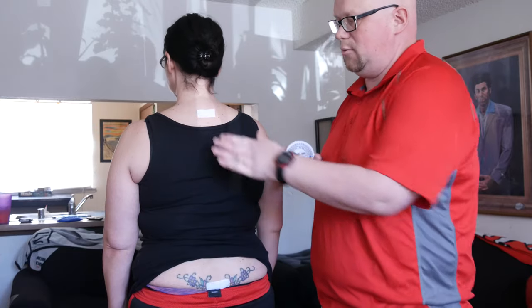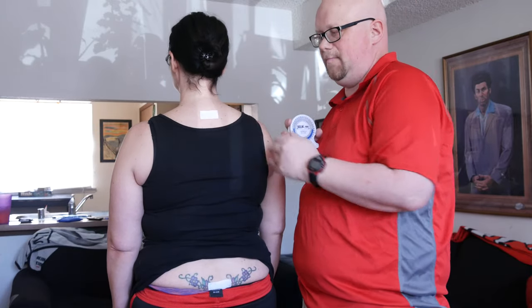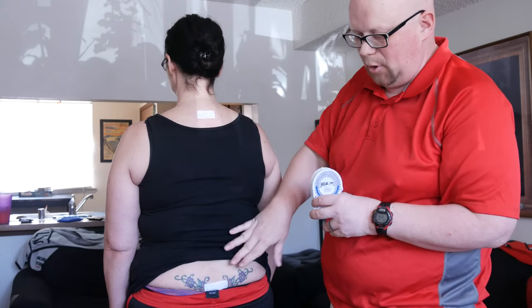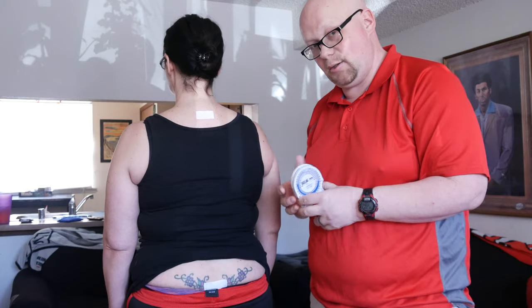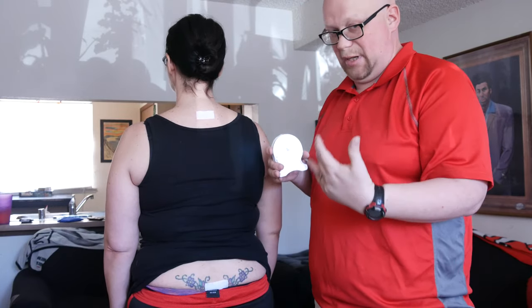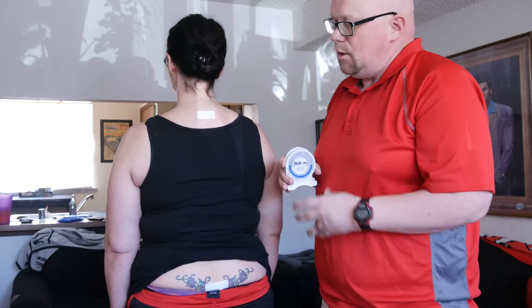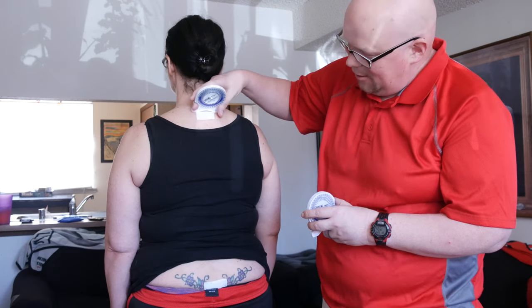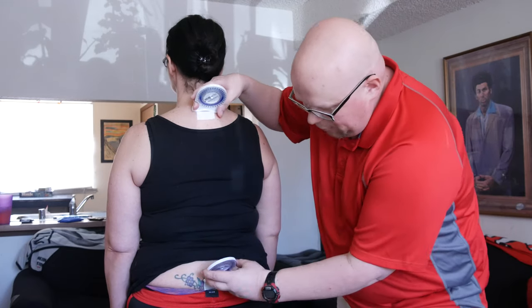On this one, what we're going to do is thoracolumbar rotation. This is one of the hardest ones with the inclinometers because it's just a little bit strange and hard to do. We're going to put them actually like this on the patient at the top of these.